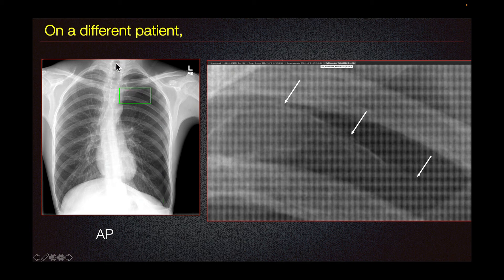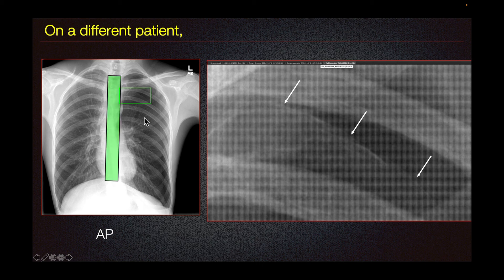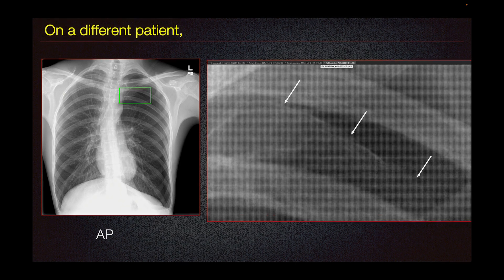We evaluate the mediastinum, such as here, and it should not shift away from the pneumothorax unless there is tension pneumothorax. Tension pneumothorax is an emergency.